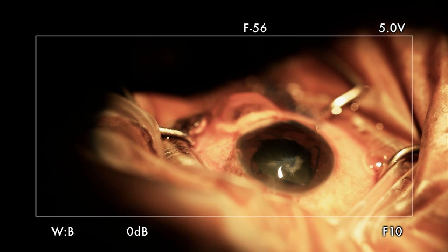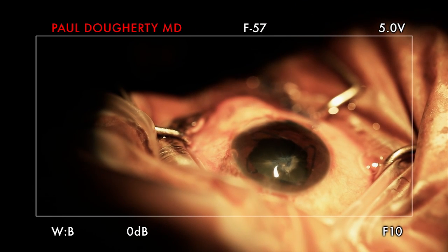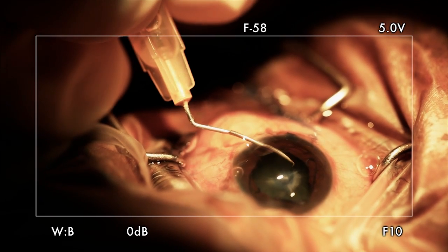Now we need it. So there's fibrosis there. Let's see if we can do a rexis around the fibrosis — I may have to.